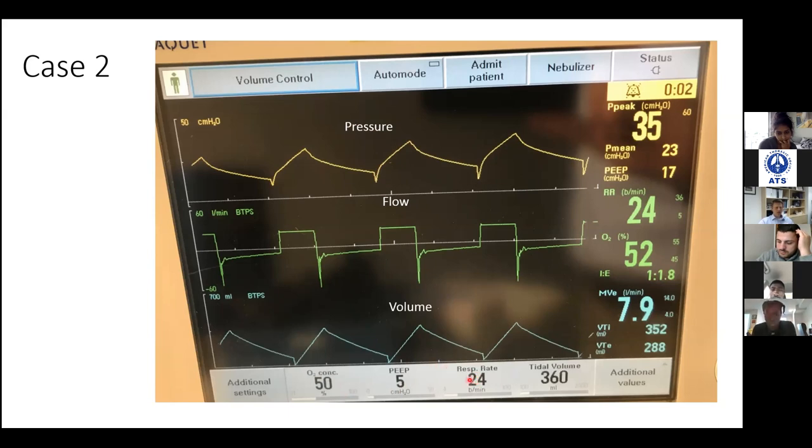And incidentally, we know that they're not triggering the vent for two reasons. One is that the respiratory rate in the patient-derived characteristics, which are over here, is the same as the set respiratory rate. The second way we know that on this ventilator is that you'll see a little yellow line if the patient initiates their own breath and triggers it on their own.